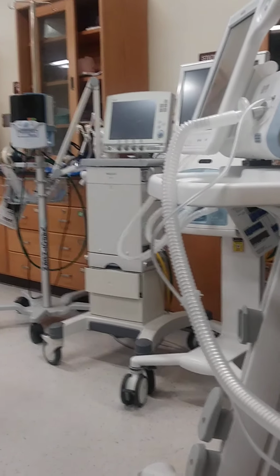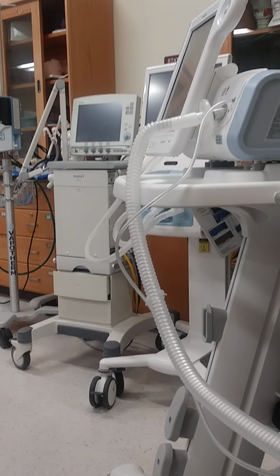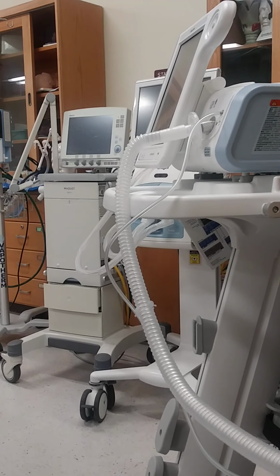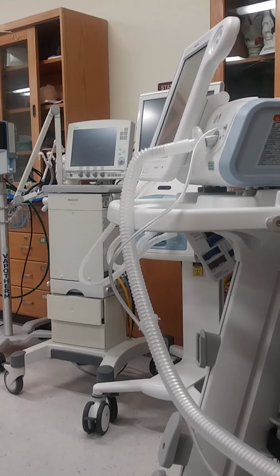So basically, this is a non-invasive way to help a patient breathe. Okay? So non-invasive, and by non-invasive we mean we're not putting anything inside of them. We're just placing a mask. It's called a BiPAP. Okay?